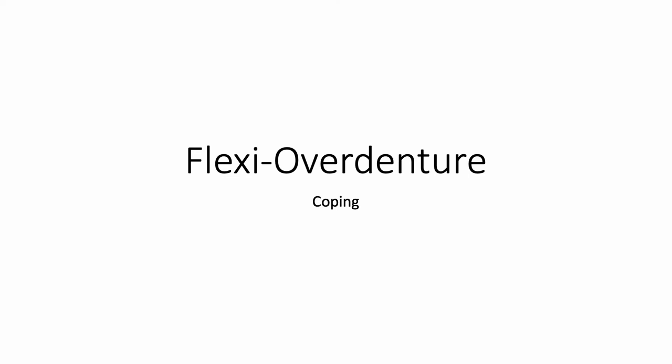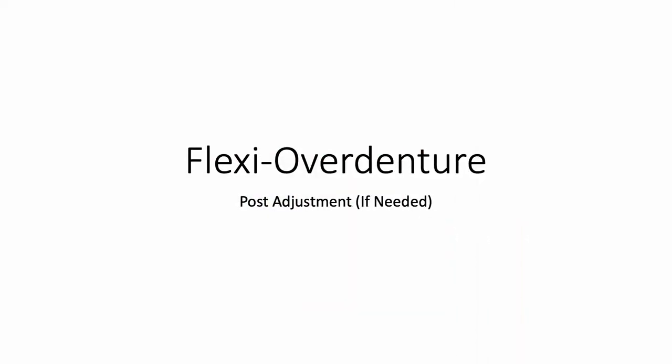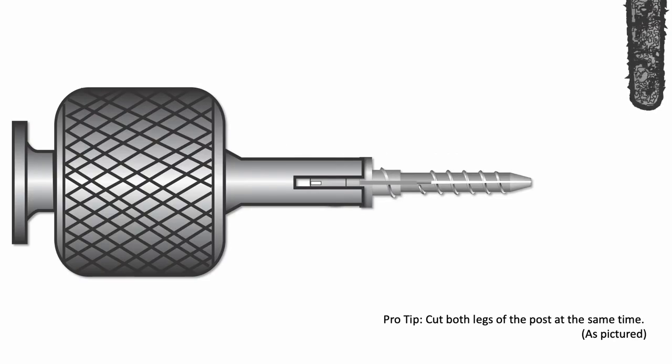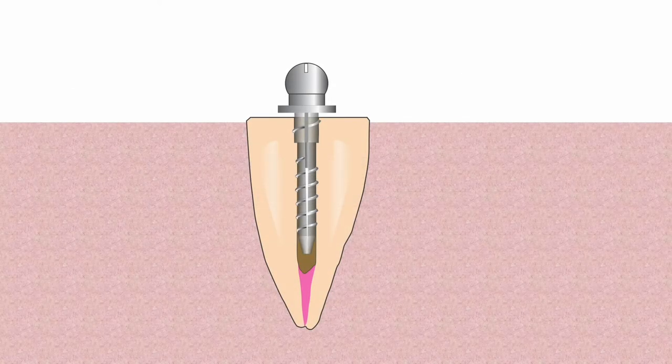When doing the indirect coping technique, half a mm of space is needed between the flange of the post and the coronal tooth structure for the coping to be placed. To achieve the half a mm of space, seat the post completely and then back off half a turn. Since the threads on the shank are 1 mm apart, half a turn backward will produce half a mm of opening. If the post is longer than the post hole, remove enough apical post length to allow the post to seat completely, and again back off half a turn to achieve the half a mm of space needed.